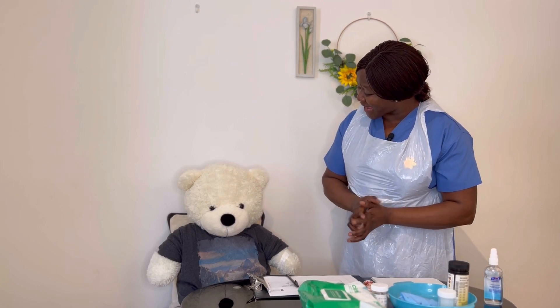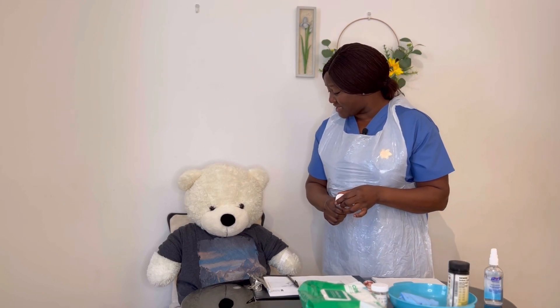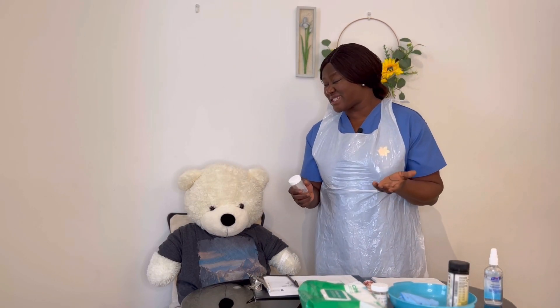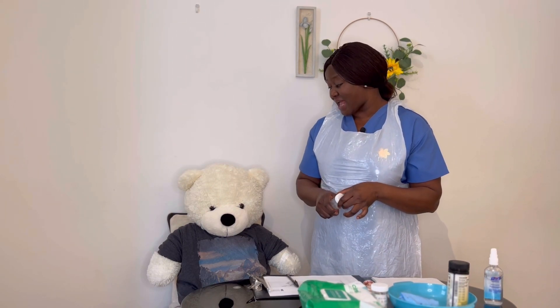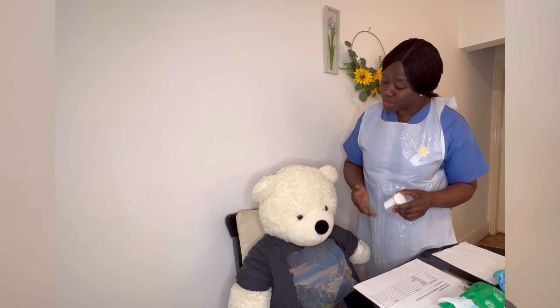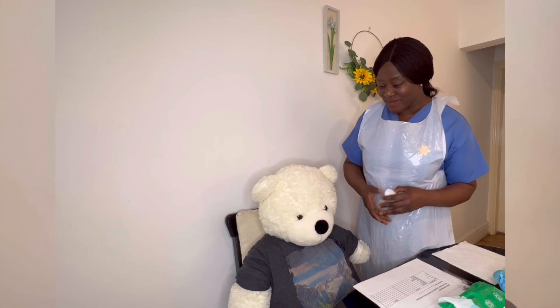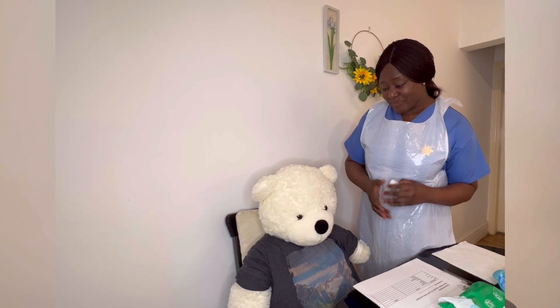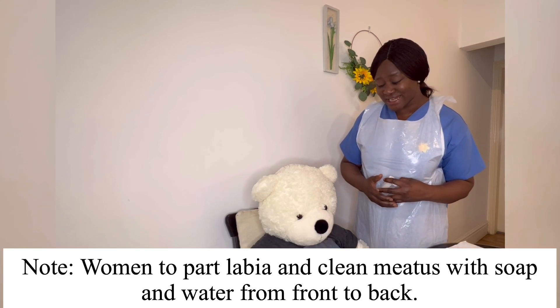Are you still happy for me to go ahead? Like I told you, I'm here to carry out a midstream urine analysis on you. This is just a test to find out if you have some abnormalities in the urine, and it is not a definitive diagnosis. I'll need to explain what you need to do. You need to go to the toilet, wash your hands with soap and water, and wash your down below with soap and water thoroughly.